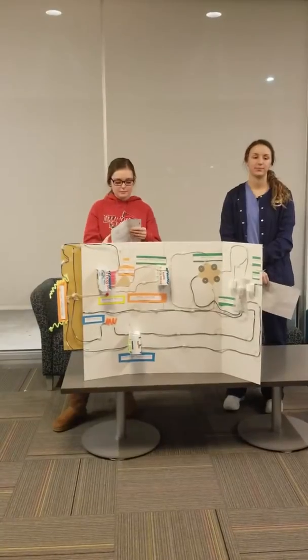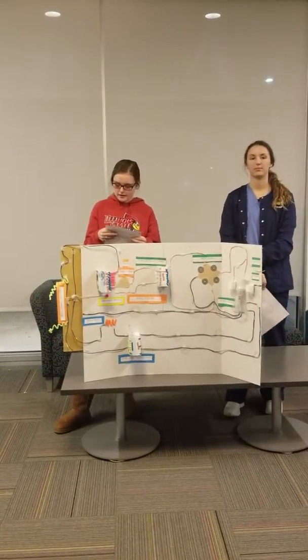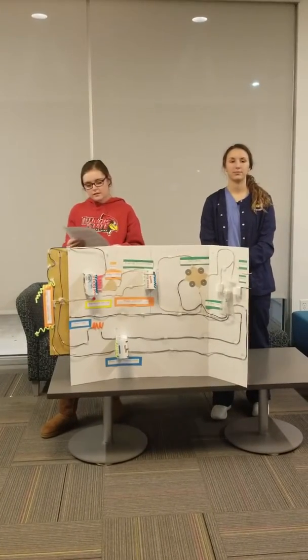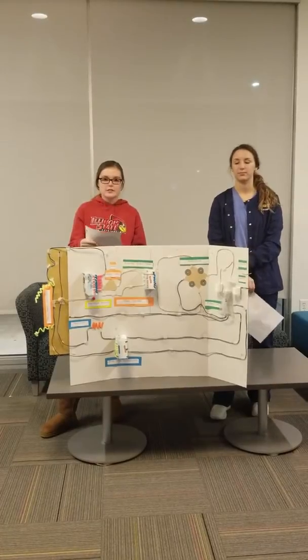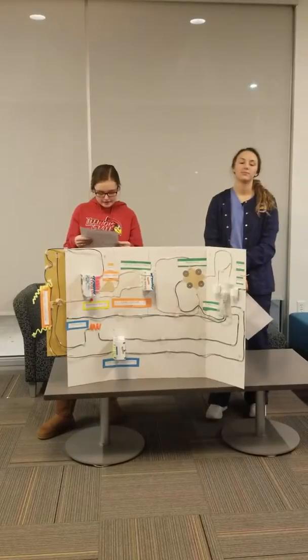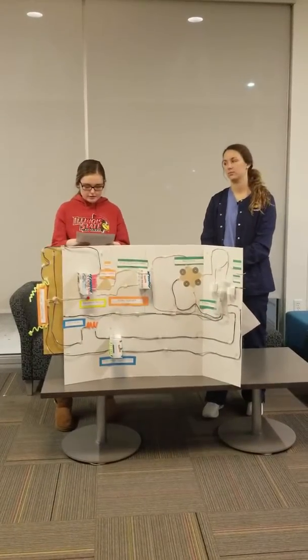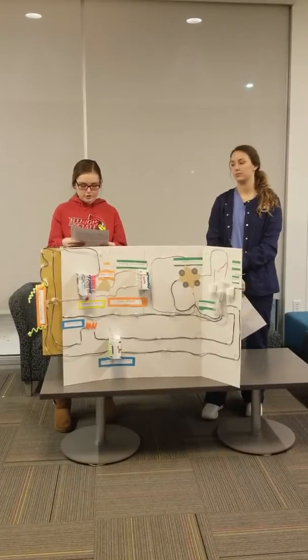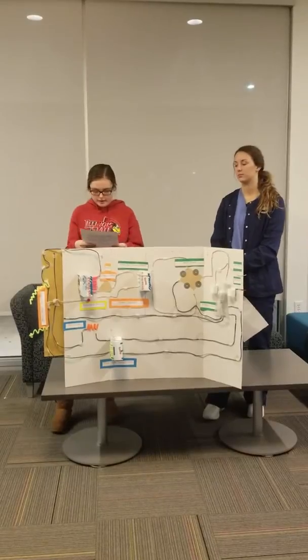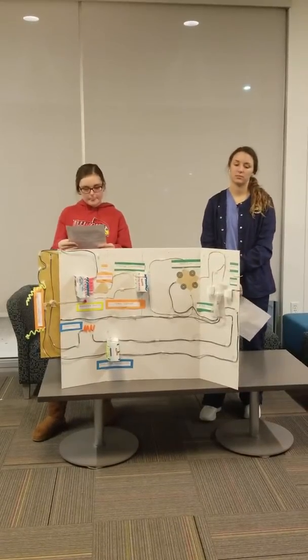Oh wait, no. I have the filament circuit, and it draws electricity from the auto transformer, which then travels to the rheostat. The filament circuit consists of the rheostat, the step-down transformer, and the filaments. The rheostat is controlled by the mA selector, so the higher the milliamperage, the lower the resistance. The rheostat also controls the filament temperature and the rate at which electrons are boiled off of the filament.